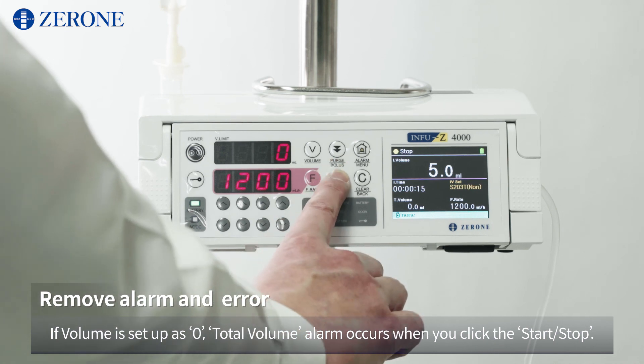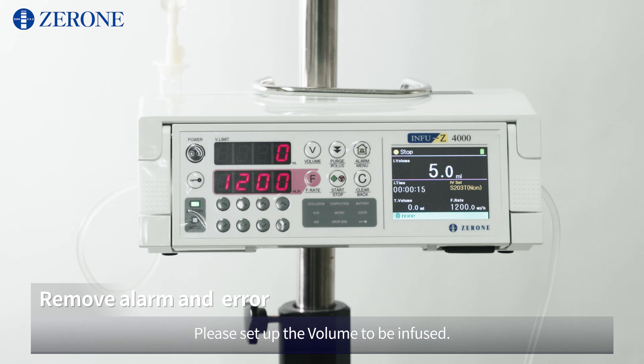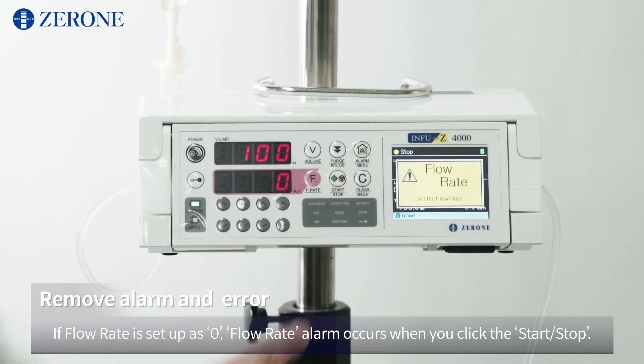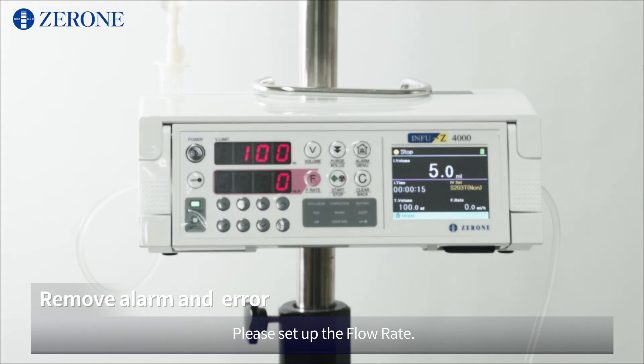If volume is set up as 0, a total volume alarm occurs when you click start/stop. Please set up the volume to be infused. If flow rate is set up as 0, a flow rate alarm occurs when you click start/stop. Please set up the flow rate.